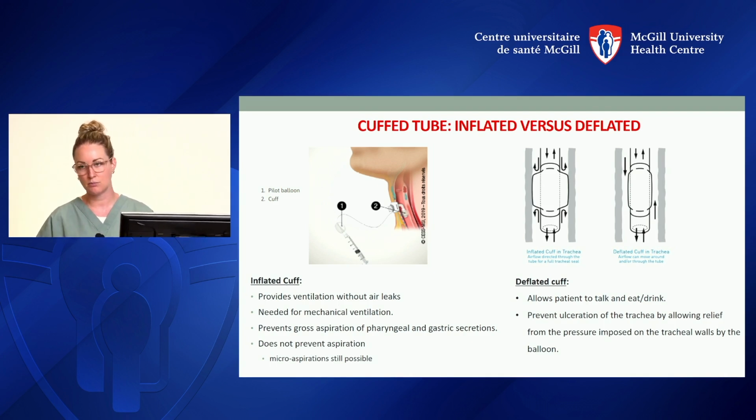And the cuff should always be deflated at all times, except in the following situations. If you're mechanically ventilated, of course it needs to be inflated, or in the event that you see sudden bright red blood coming from the tracheostomy tube, you can inflate the cuff.